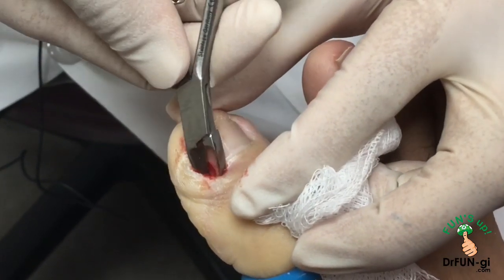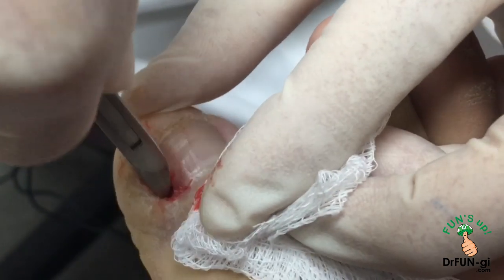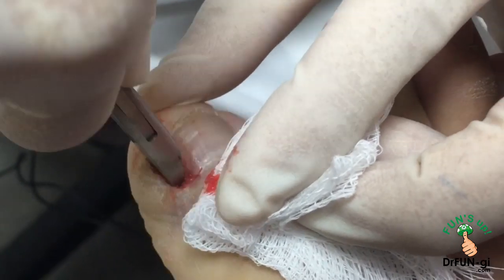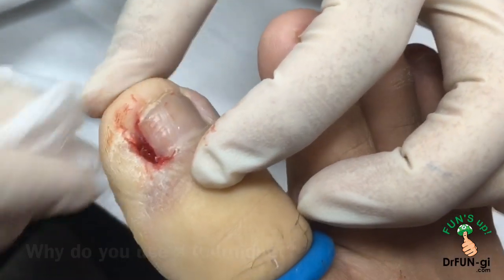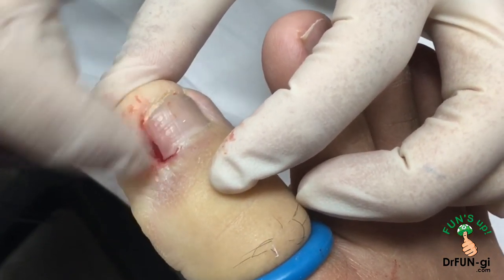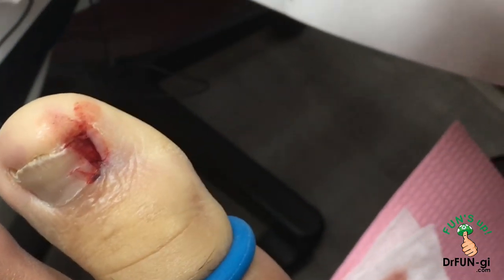It's almost done now, so I'll make sure that everything's out of that corner so it drains nicely and heals. It looks really good now. There's a piece that needs to come out as well to make sure it looks nice after. This is to stop the bleeding — it's pretty bloody and we want to make sure that I can see what I'm doing. A lot of times I can leave a little spicule of the nail in there, and if I don't see it properly I may leave it in there, which is a big problem. That's why I use a tourniquet to stop the bleeding to that area.